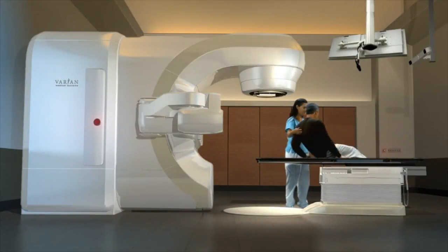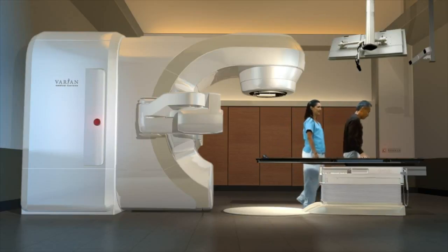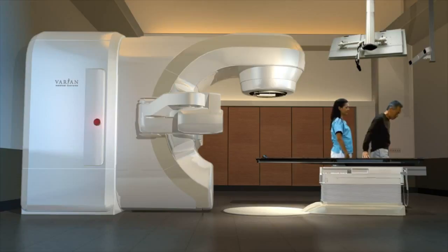Depending upon your overall treatment plan, your sessions can last approximately 2 to 15 minutes. Typically, the first treatment is the longest.